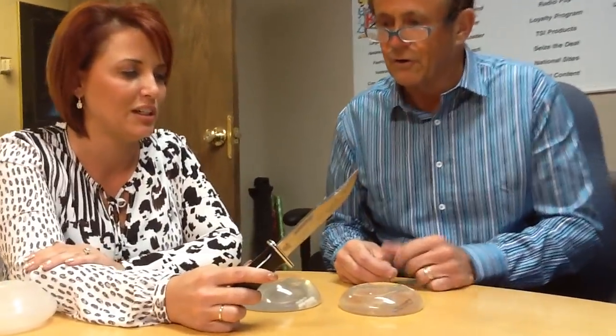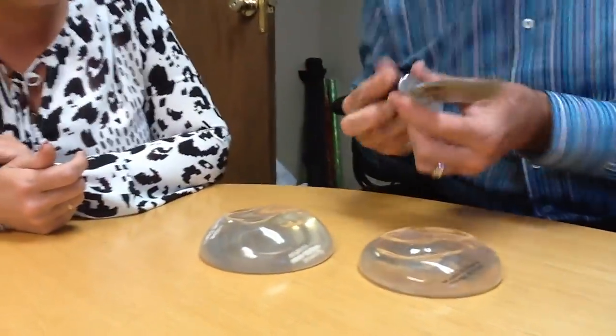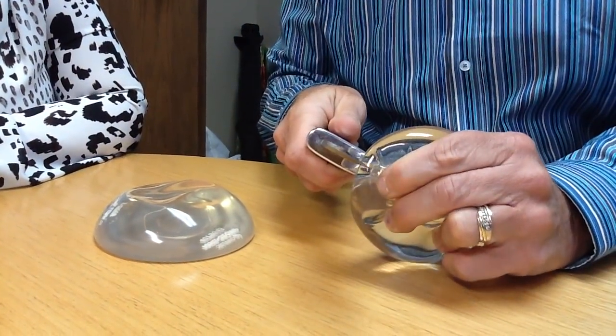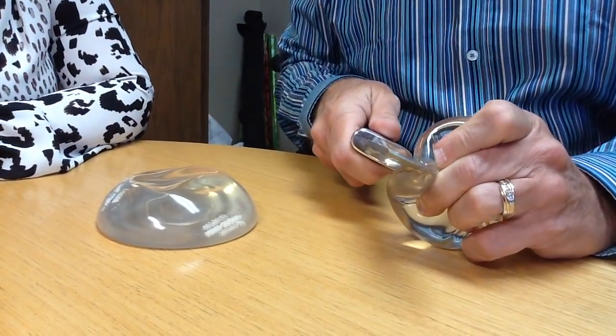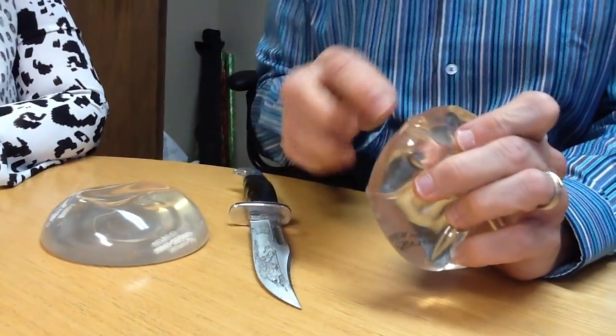We're going to cut these open and show the difference in the cohesiveness of the gel. This is not how he does it on the operating table. It's pretty sturdy — if that's inside your body, it takes a lot. Okay, now we've ruptured it.